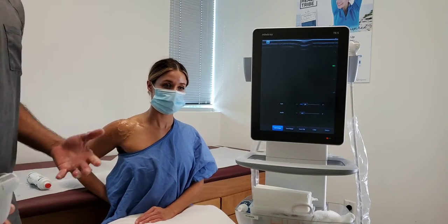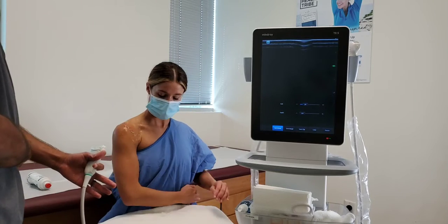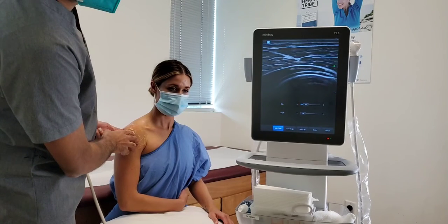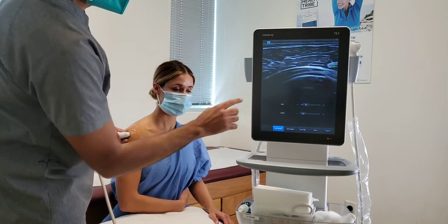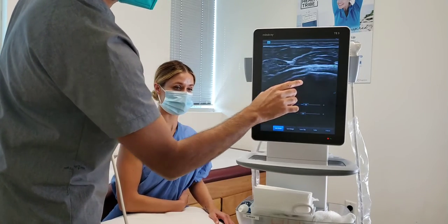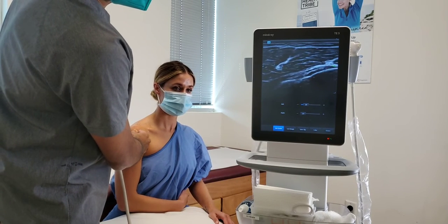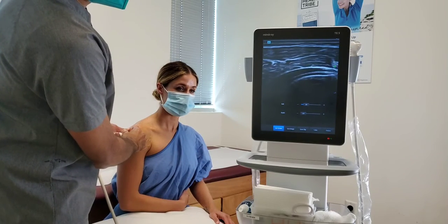So from here, we go to look at the back of the shoulder and the rotator cuff in the back. I'm going to have you put your hand across your chest like that. And now we're going to look at the rotator cuff tendon called the infraspinatus, which is on the back of the shoulder. Again, here's the arm bone, the head of the humerus, and here are the tendon fibers that come across and attach over here. This tendon is a lot thinner than the tendon of the supraspinatus, but it goes all the way and attaches over here. And we can track that down, it becomes muscle.